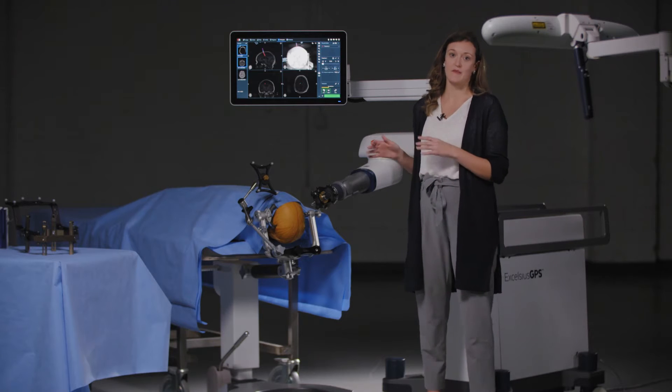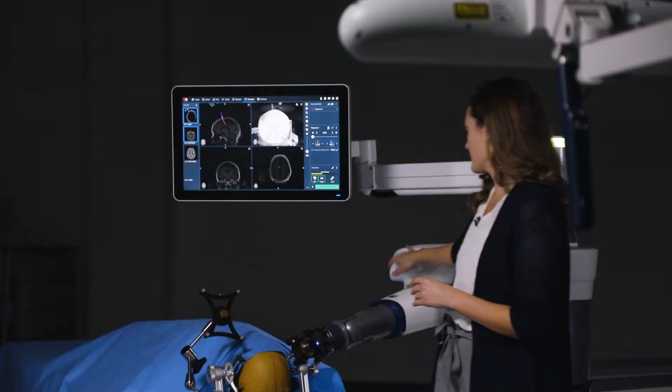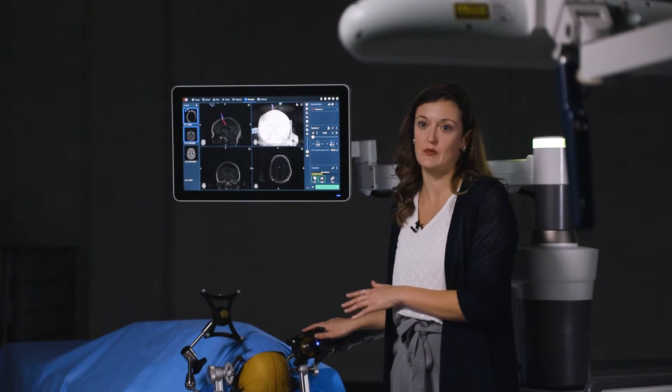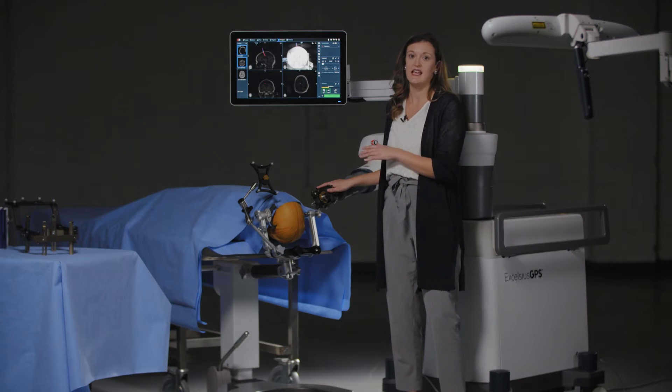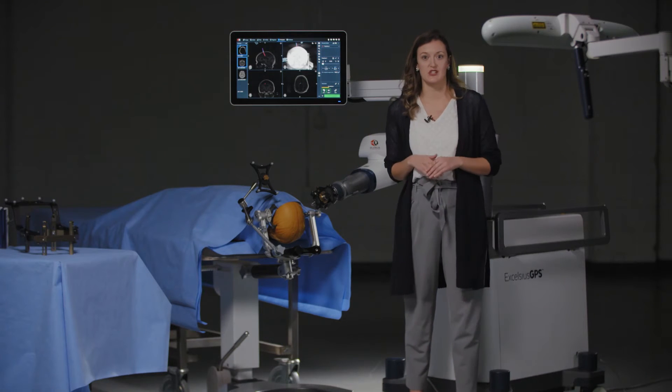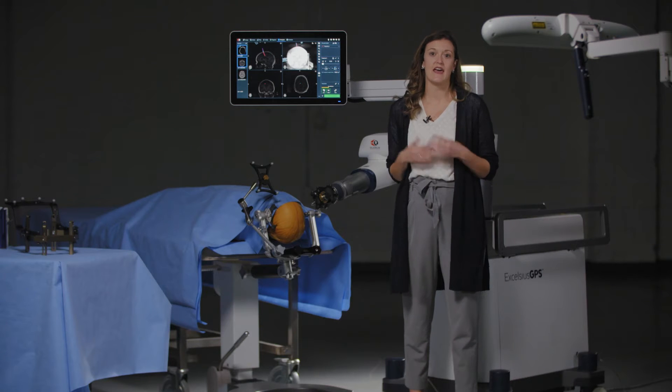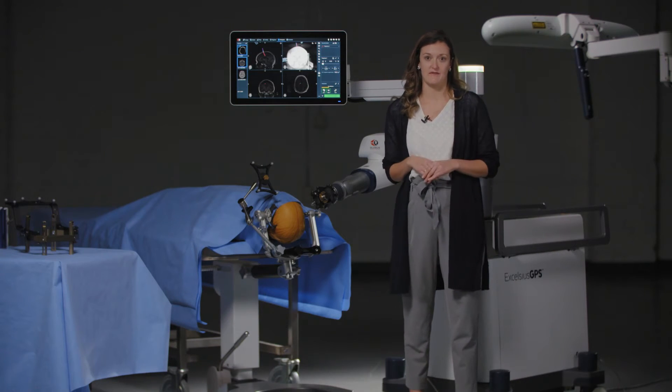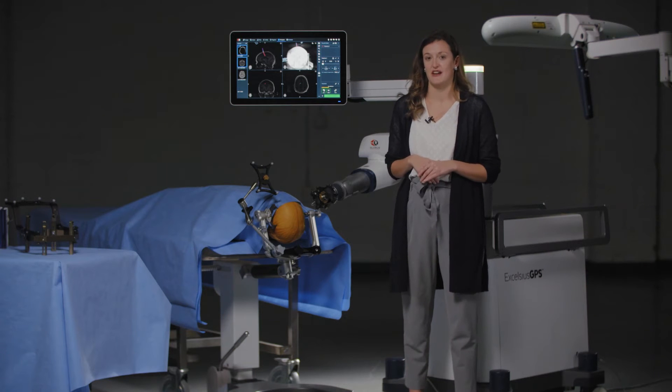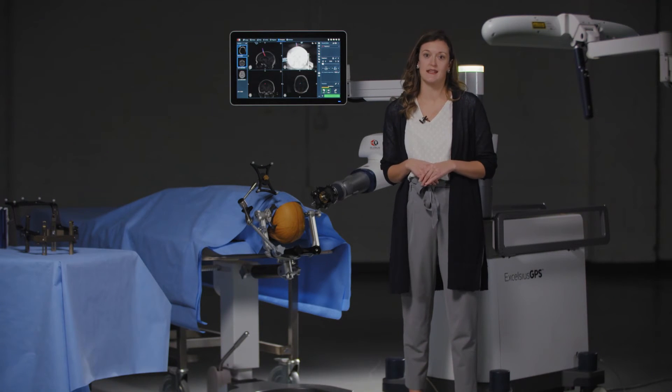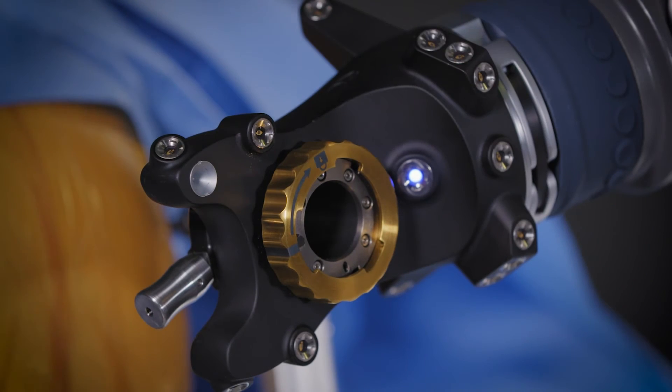This stability is transferred from the base station through the rigid robotic arm and to the interchangeable guide end effector. This end effector is specific to cranial procedures and acts as the interface between the instruments and the robotic system, through active navigation and precise alignment. The modular design of this end effector adapts to different instrument diameters through a series of interchangeable guide tubes.